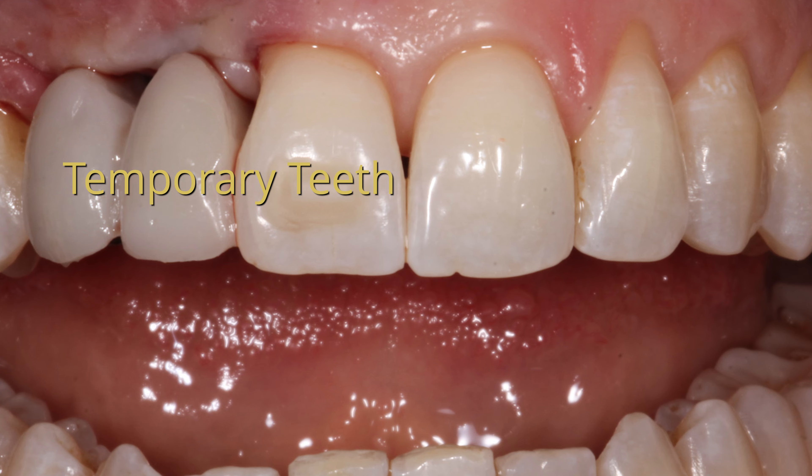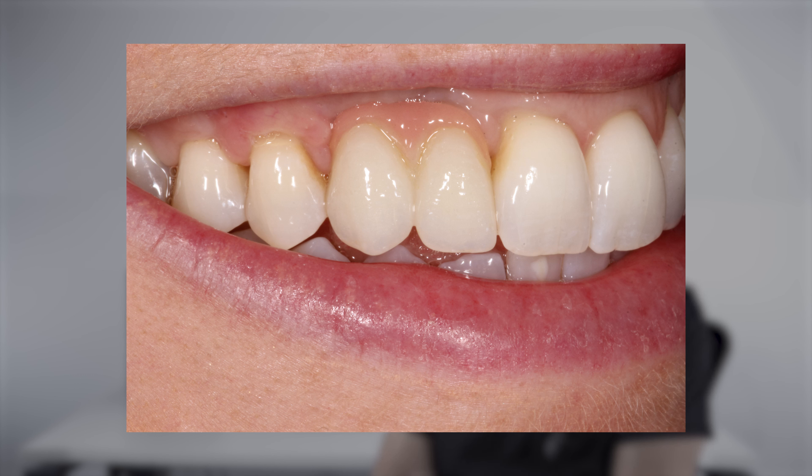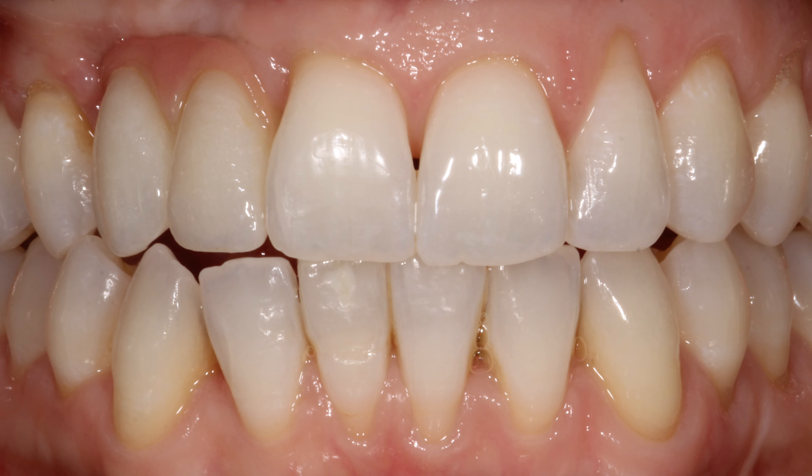My point is she had a lot of surgeries to get her to the point where she could have teeth. And even after all of that, the teeth still didn't look perfect — they didn't look as good as they would have done on the other side. That pink papilla was missing. When the pink papilla is missing, the teeth can look too blocky. So even though it's not obvious what is wrong with it, left and right looks different — there's a really obvious imbalance there. So in this case, we resorted to using pink porcelain. And this is the result. You can see that pink porcelain, especially in these closeup photos.